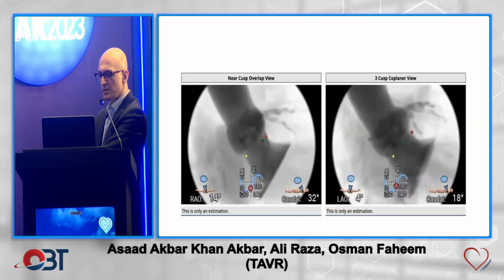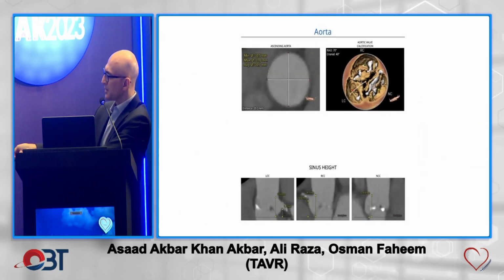And if you look at this case, so that's the left coronary and it's visibly low. Now if you just look at the leaflet height or length, and you imagine that the leaflet is going to be pushed over when the valve goes in, it looks like the leaflet will obstruct the coronary. But then you look at this sinus depth, and so there will be room behind that pushed back leaflet for blood to get into, and the STJ is high. So even though the leaflet is going to end up somewhere around here, the blood will be able to come behind the stent of the valve and still fill the left main.